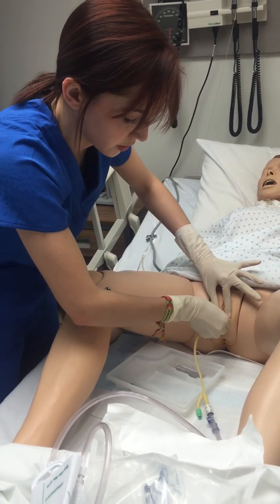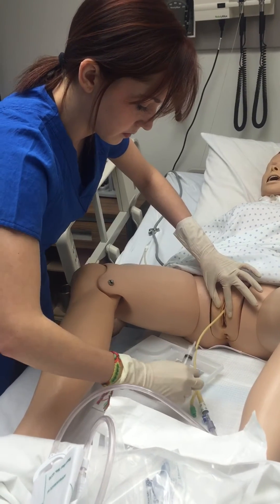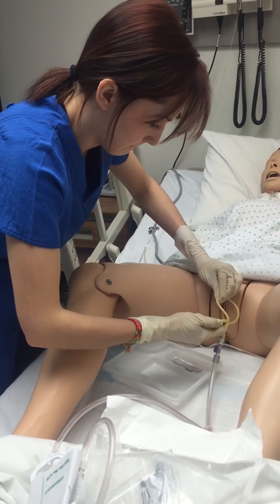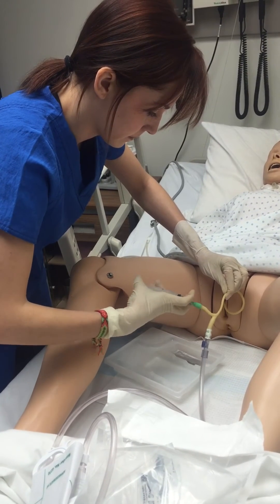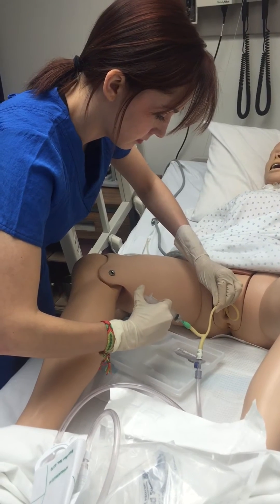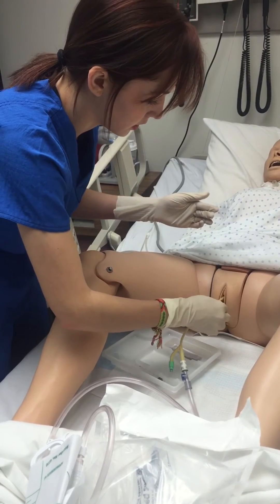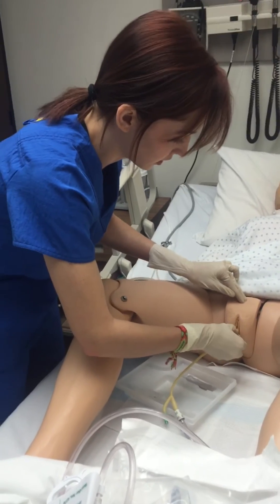I will take the lubricated end and insert the catheter, and then I would go until I get urine return. Now I will take this and inflate the balloon. Then I would pull until there is a little resistance — I feel that — so I would push in a little bit.